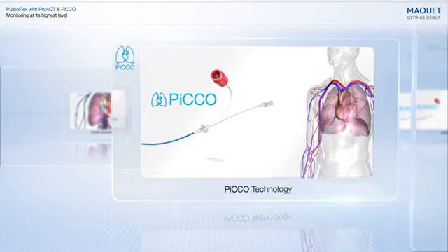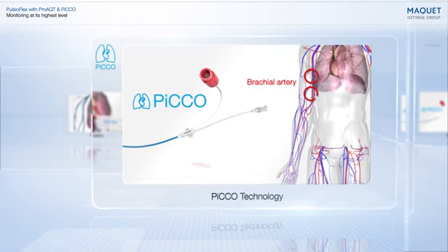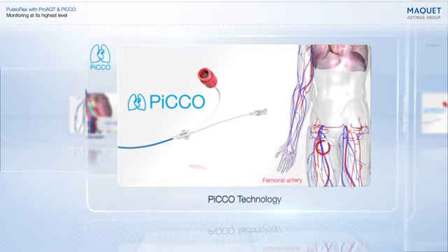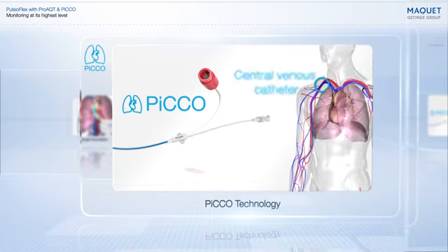In order to use PiCCO, a dedicated catheter is needed, which can be inserted into the brachial, axillary, or femoral artery. In addition, a standard central venous catheter is required.